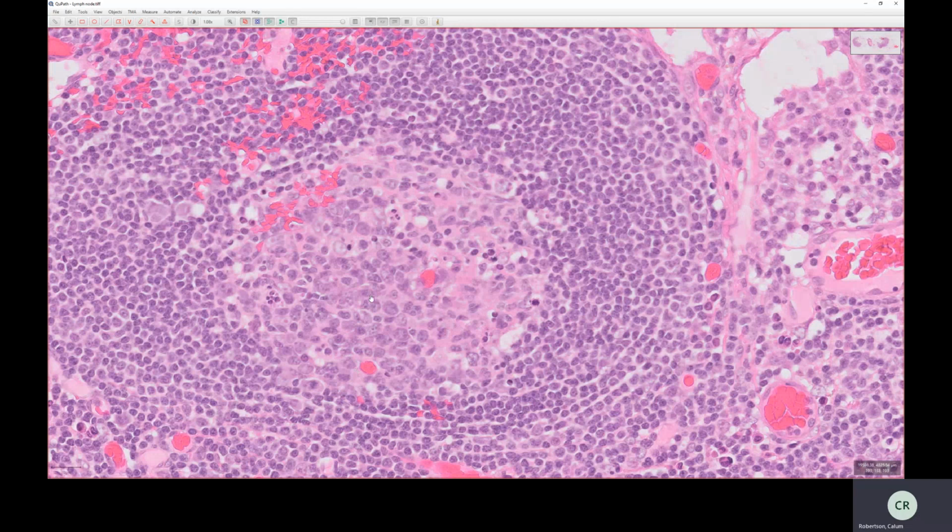activated B cells. Within the other half are centrocytes, and these are much smaller cells that are often elongated and notched. They have a notch taken out of them. You imagine here as though someone's taken a bite out of this apple. There's a notch out of the center of it. Here's another one, sometimes called cleaved.